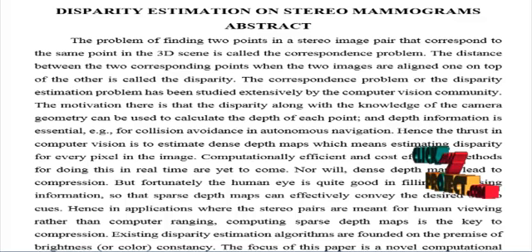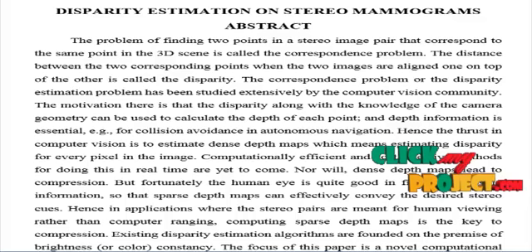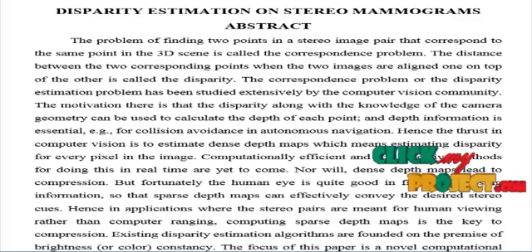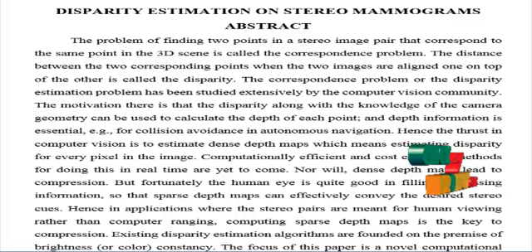The weightage values W1 and W2 were extracted by applying the singularity index to the image. The singularity index is calculated as the average value of the first and second order derivatives of the input images. The stereo model is then generated based on the calculated weightage and the disparity term. The new disparity term is identified based on the updating of the terms, calculated from the updated weightage functions.